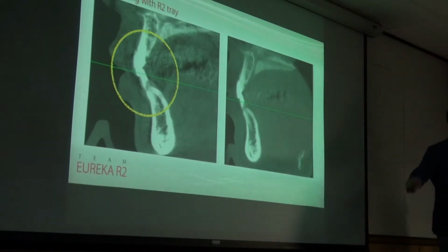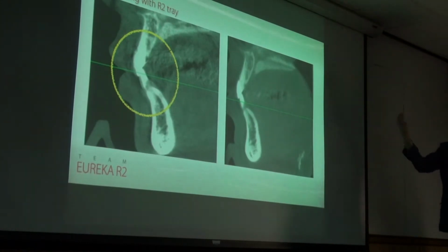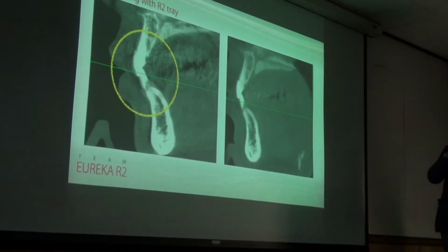It means, do you know the principle of CBCT taking? It has this kind of architecture here, and it is rotating. And sometimes the machine touches the patient's shoulder. At that time, the patient moves, and then we can obtain this kind of trembling.